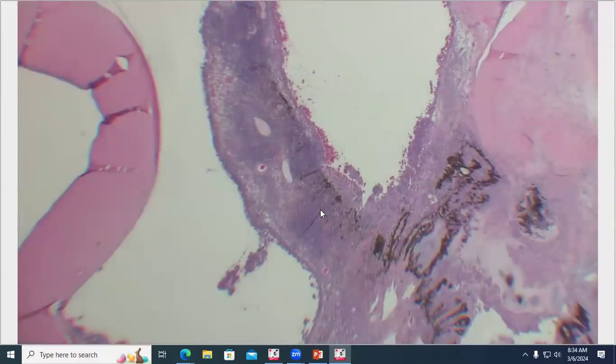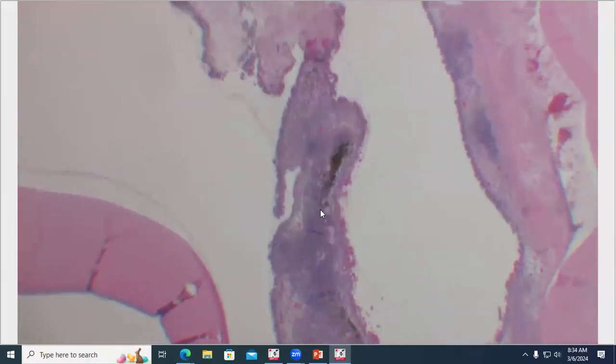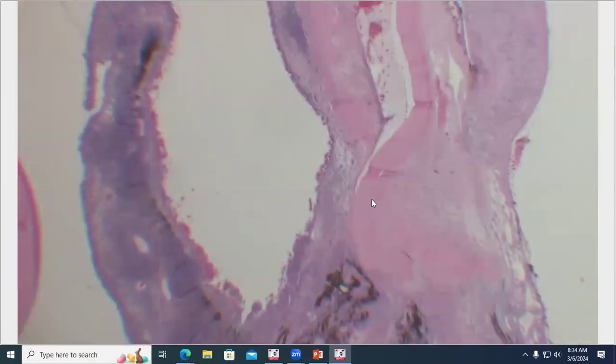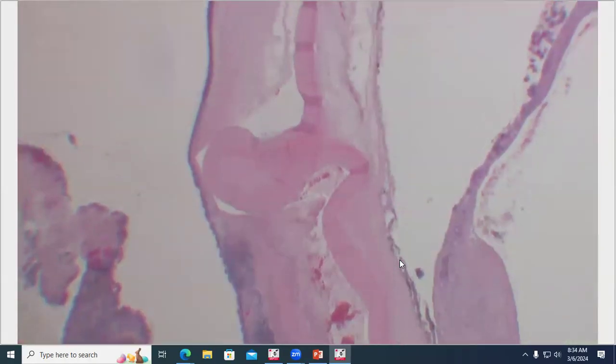And then here's just, again, more cellular infiltrate into the iris leaflets. All right. So this iris leaflet, you can see is hypercellular. And maybe from low power, you get a sense that it looks a little bit inflammatory on this side. We'll just stay at this power and keep moving along. Here is lens capsule, kind of squiggles out here a little bit as we follow this along.